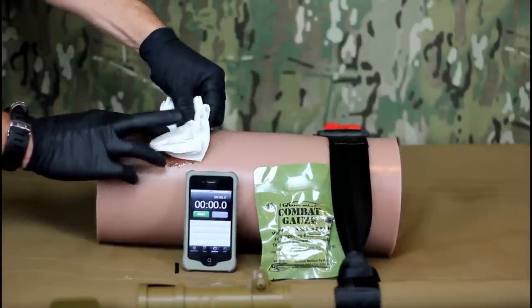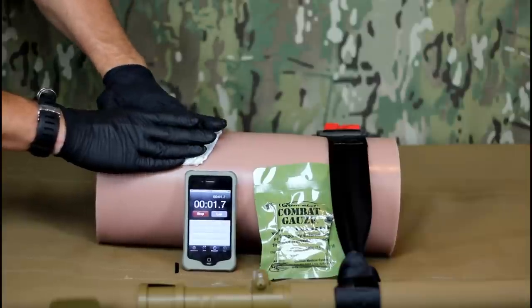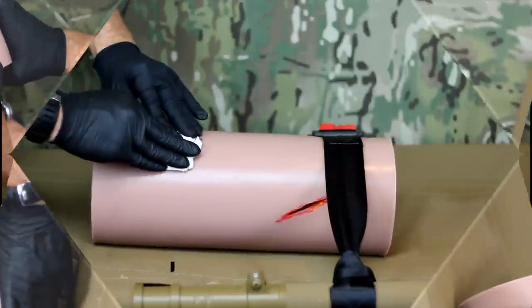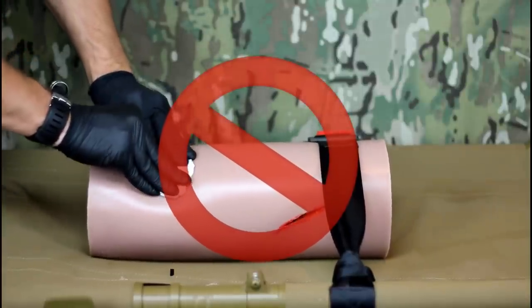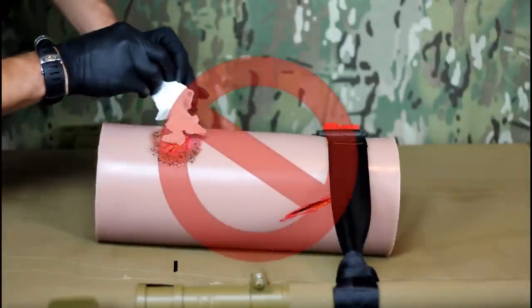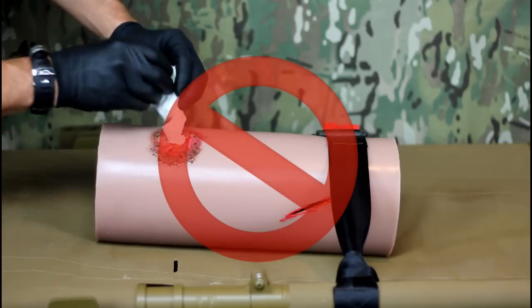Once the wound is fully packed, use any excess gauze to continue to apply pressure over the wound for at least three minutes. It is important to maintain consistent pressure. Do not push up and down on the wound or move the gauze unnecessarily. Do not lift the gauze away from the wound to see if bleeding has stopped.